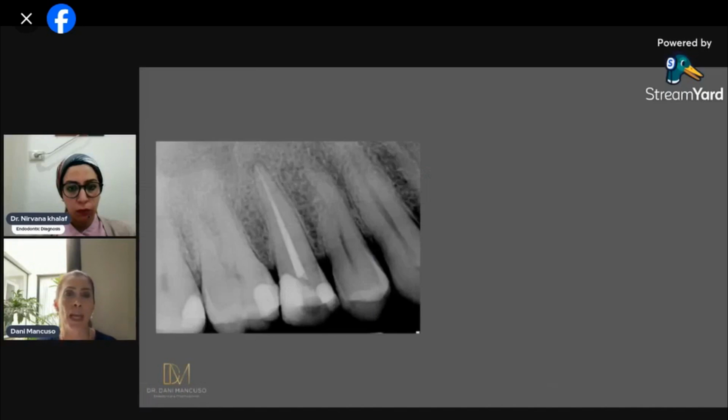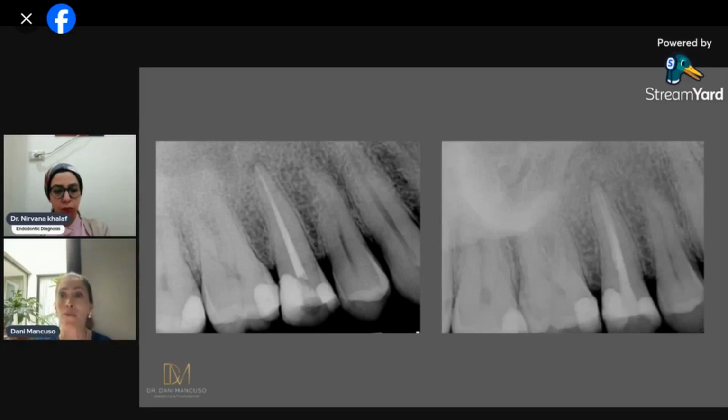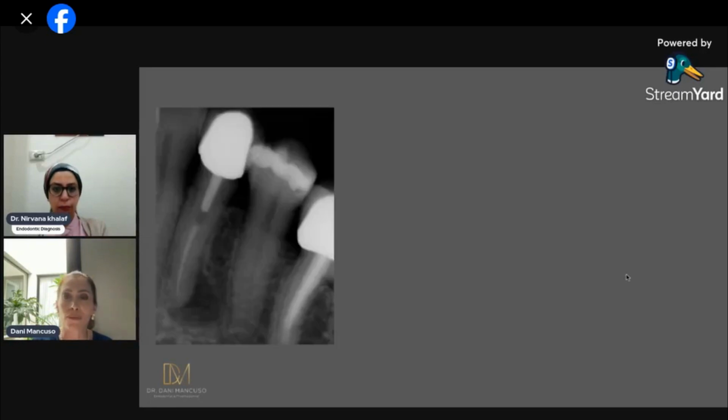What about if you did your root canal treatment? You think that root only has one canal, it is pretty centered, and you say, but it's not healing. That's another thing. Instead of opening that tooth and going buccally, palatally, and destroying the whole coronal part, take a scan. In this case, we took a scan. I don't have the scan to show, but we saw that the canal was more buccal, and we could do the root canal treatment over here, preserving the same access that we had done instead of extending too much and destroying that part.